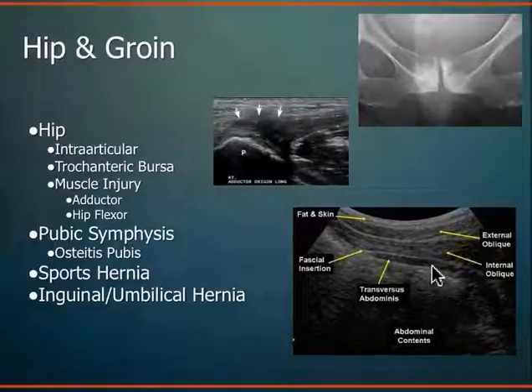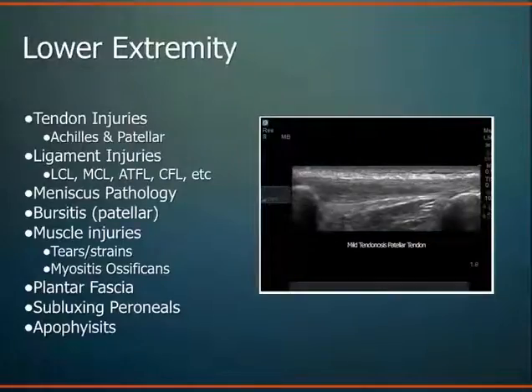muscle tissues that sometimes can be involved in sports hernia that you can see quite well with ultrasound. Another very common source of pain in the groin, in athletes particularly, is osteitis pubis, or just chronic changes at the pubic symphysis, inflammation. The best way to work through your differential on that is to inject it. And it's obviously a sensitive area to inject, so you want to have image guidance. You can see it quite well on ultrasound and use ultrasound guidance for those injections.